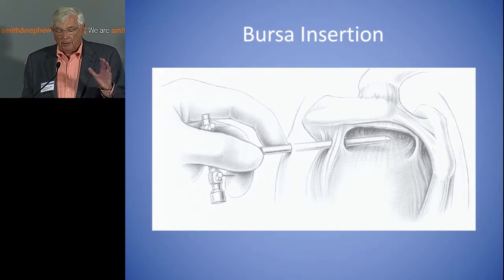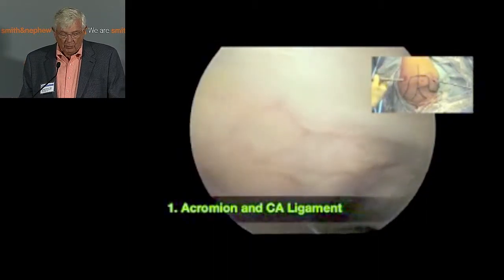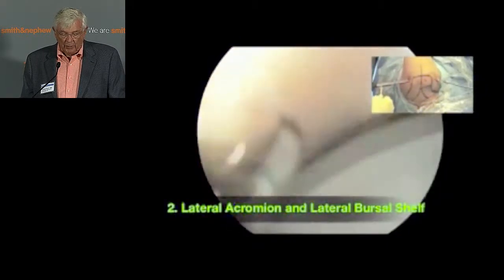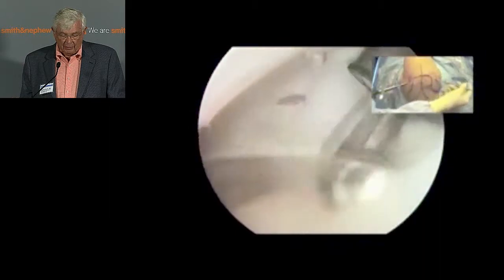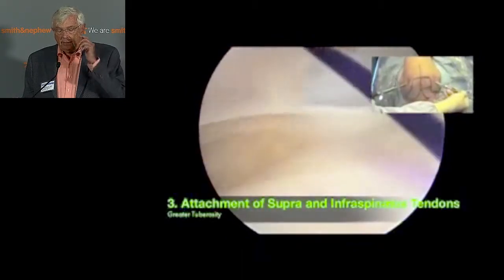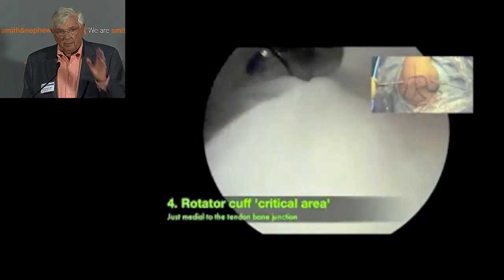So then there's the bursa. Sometimes I'll do a bursoscopy on a patient before I do the glenohumeral joint arthroscopy. Here you're looking into the bursa — Dr. Snyder has a bunch of numbered zones up there. The idea is you should be able to be in this bursa and see what's going on. If you hug the top of the cuff, you can look at the acromion, see the ligament, and see if there's any scuffing. Now there's a marker on the rotator cuff. You can look down on the top of the cuff in the little bands — you can call them shoulder plicas if you like the word plica. The idea is just to take a few minutes to look around and see what you're actually dealing with, and have a systematic way to do an examination.